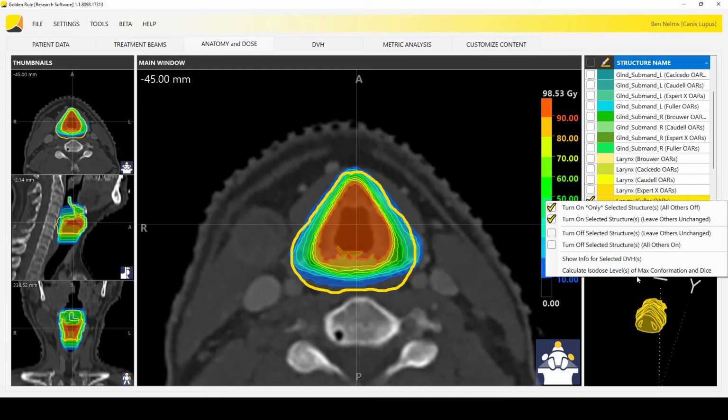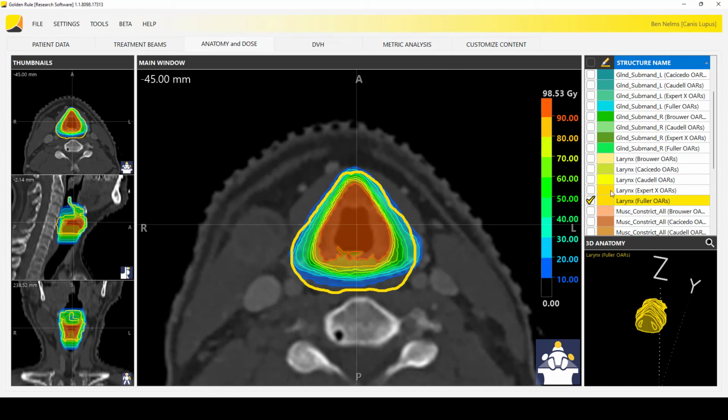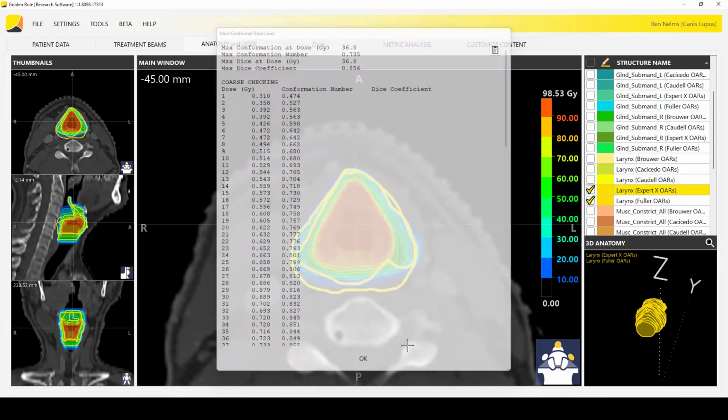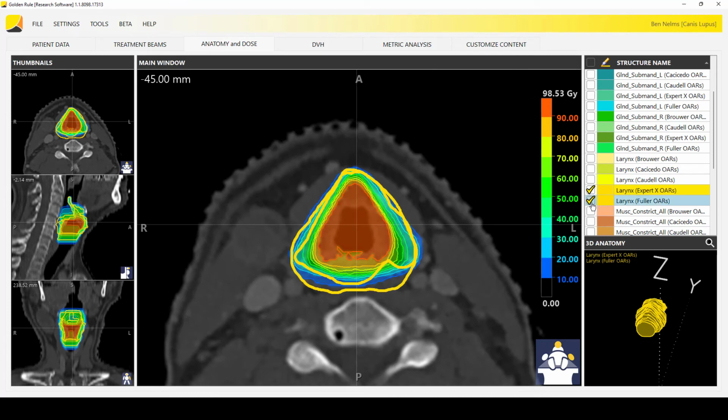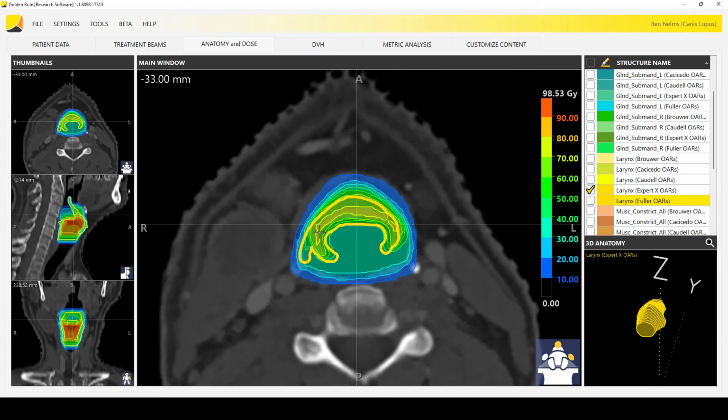I've got to highlight. So these two experts do have a high matching with the consensus levels at 30%. And in this case, yeah, in the 30s. Look at this dice coefficient, 0.856. So this expert X, I don't know who that was, but it's real interesting. It does start to look like a portion of an ISO agreement line of the population.